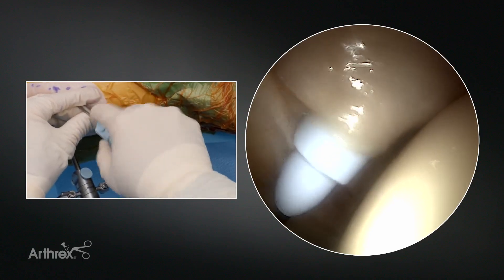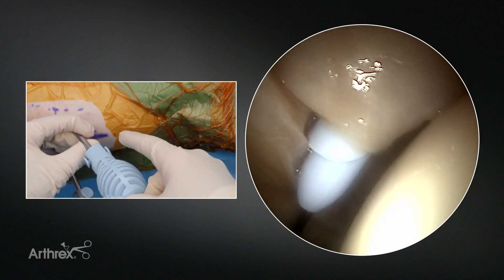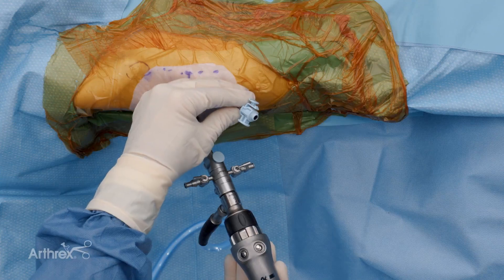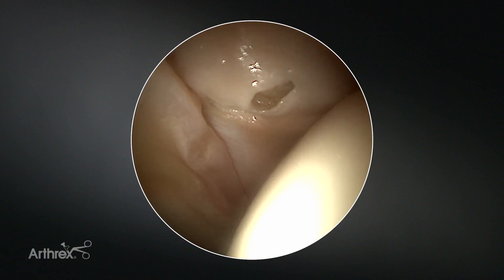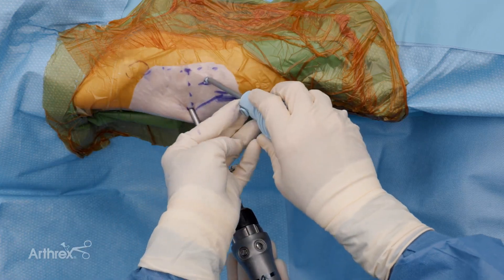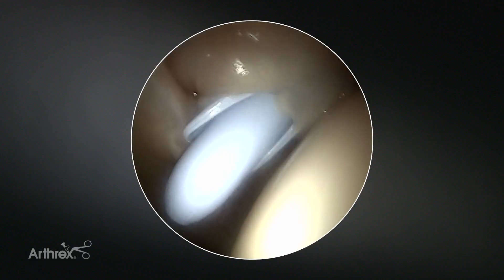With traditional systems, the all-inside approach is risky because a rigid metal cannula comes directly across the labrum. Note how the flush fit does not create problems here. The preferred approach is to bring just the tip of the obturator into the joint, remove the wire, release the surgeon's side tab, and leave the obturator in position while making the capsule cut. We bring the cutting instrument down through the 5mm flush fit cannula — the flush fit cannula rests on the outer capsule — making simple inside-out moves to create a small periportal capsulotomy. This provides the right amount of room to replace the obturator, realign, click into position, and twist smoothly, leaving the soft flush fit edge of the cannula in place.